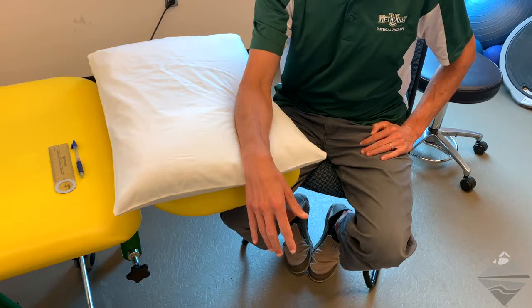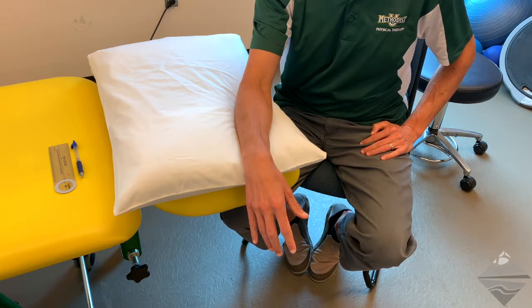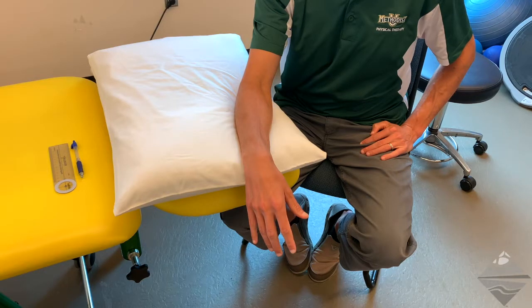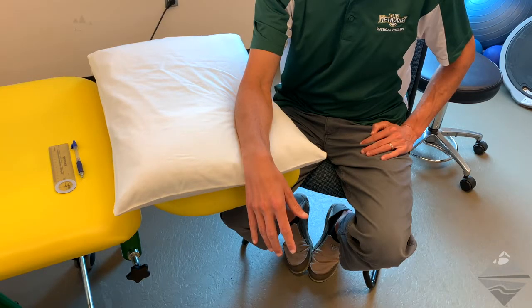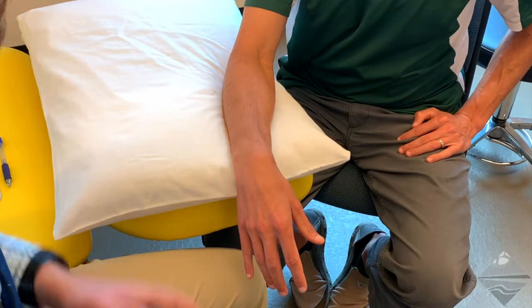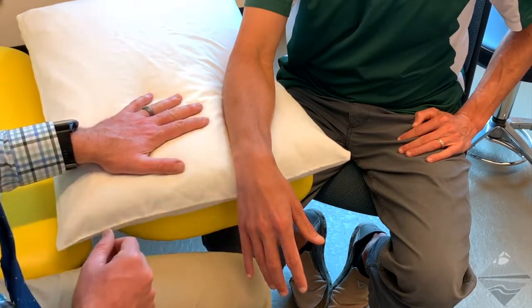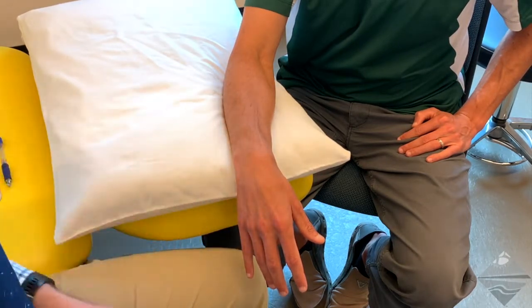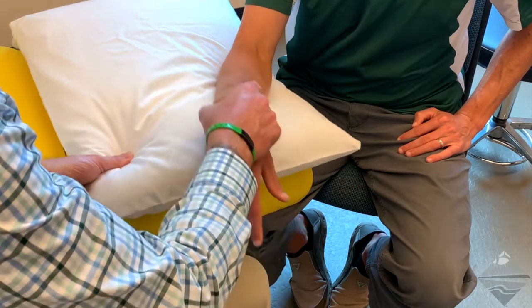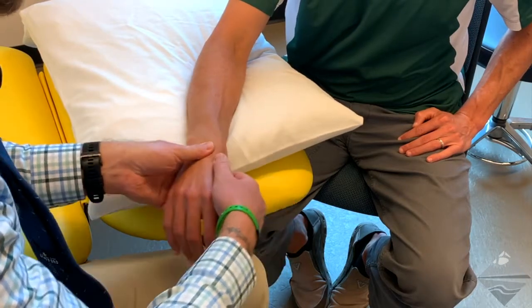This video is going to walk individuals through active and passive range of motion assessment of the wrist and hand, along with goniometric assessment. For assessment of the wrist and hand, I typically like to have the individual in a seated position with the forearm supported either by a pillow or some other form of bolster, arranged such that the wrist and hand is still free to move.